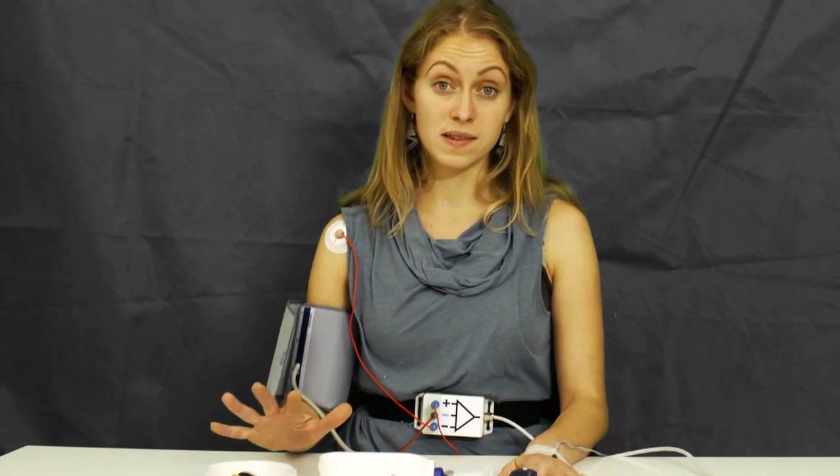Me smoking the cigarette and taking all the measurements will take about 15 minutes to record, so we shall show this in a time-lapse.